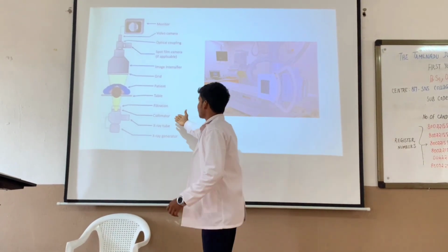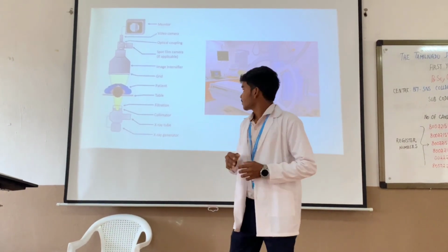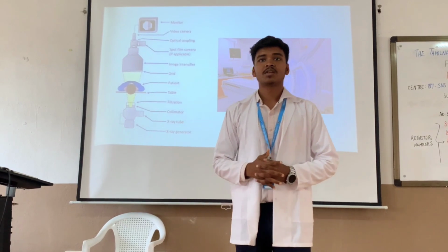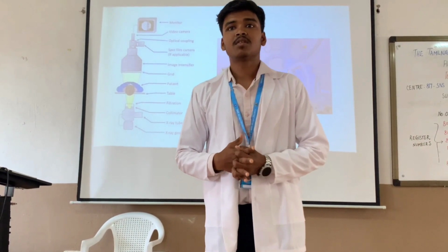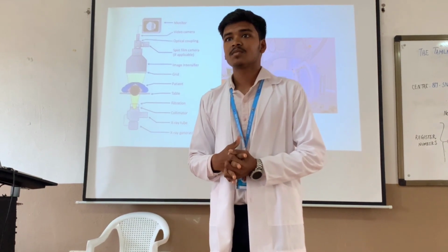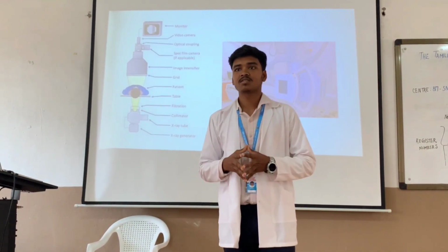Then the collimator for collimation of the region of interest, and filtration. So what is the function of filtration? Note it. The filters.